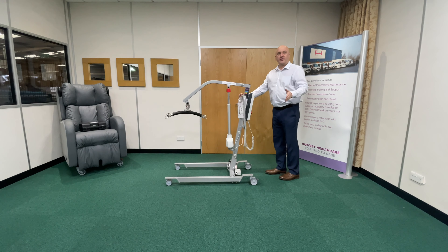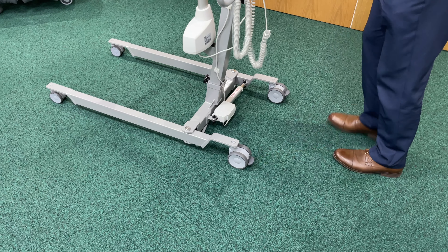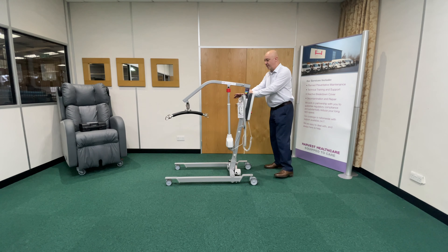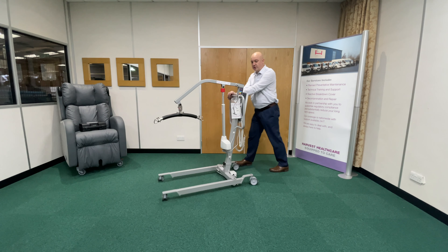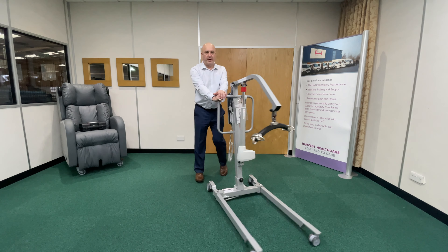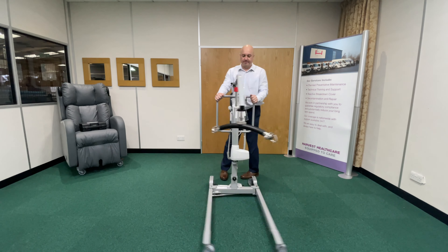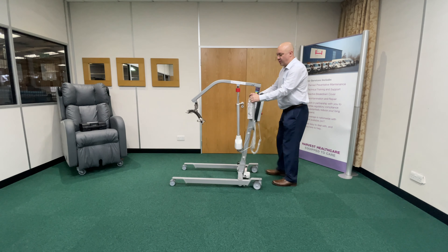Quick tip for you: if I want to turn to the left, I'm going to put the left handbrake on, and instead of pushing the hoist with two hands here, I'm going to put both hands on the right-hand side, push the hoist, and it will turn all the way around for me — and there's no twisting on my spine. If I swing it all the way back, take the brake off.